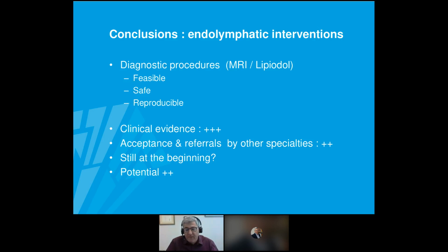And slowly means that you really see the progression of your Lipiodol on X-ray guidance, and that's in most of the cases enough. Another important point is that, even if you do it slowly, you might sometimes have some leakage at the groin itself, meaning that Lipiodol might extravasate a little bit out of the lymph node which you punctured and targeted with your spinal needle.